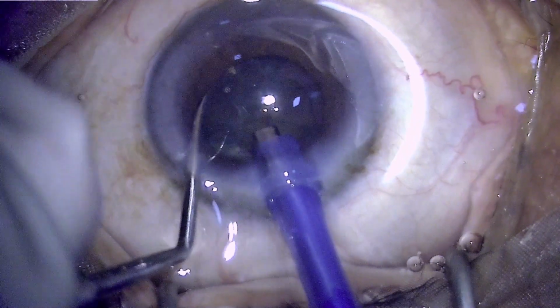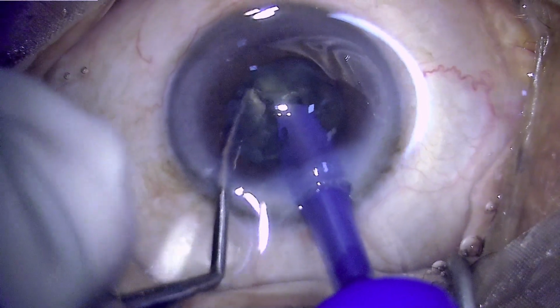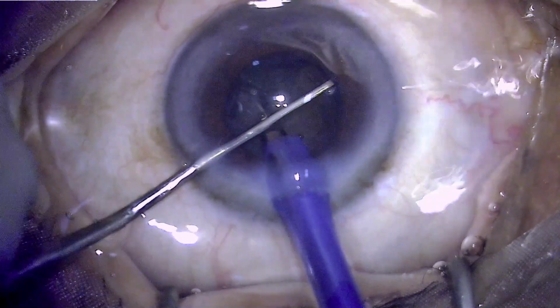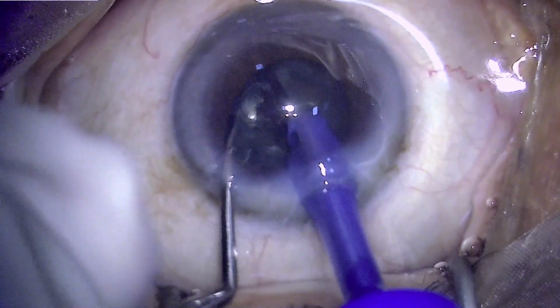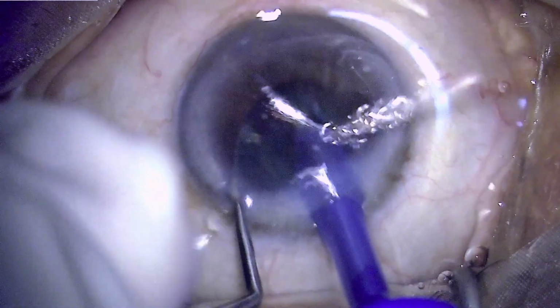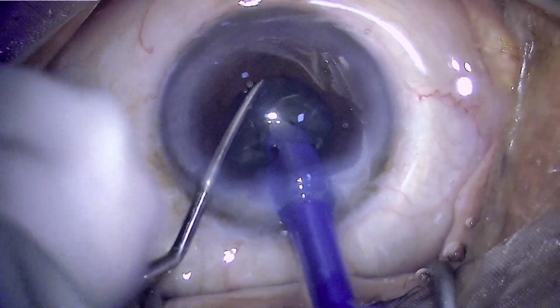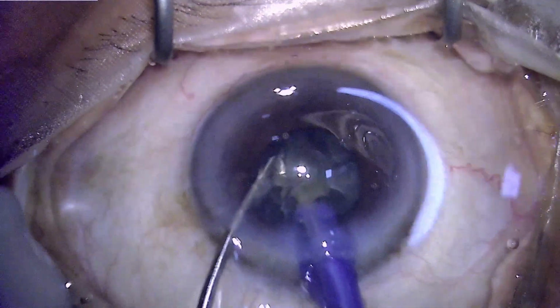The primary chop has been done, and now rotating the nucleus for another chop. I prefer that we make multiple chops so as to make the pieces as small as possible, so that the dissection of the nucleus and the emulsification process doesn't cause these pieces to protrude out into the anterior chamber or to touch the endothelium.